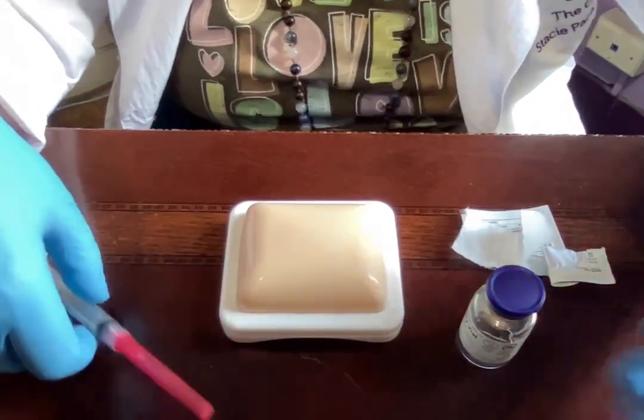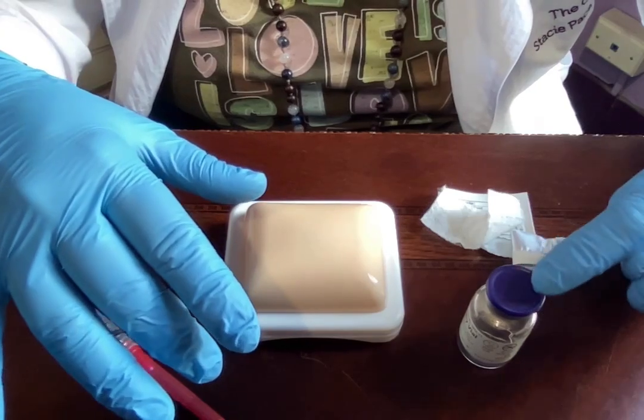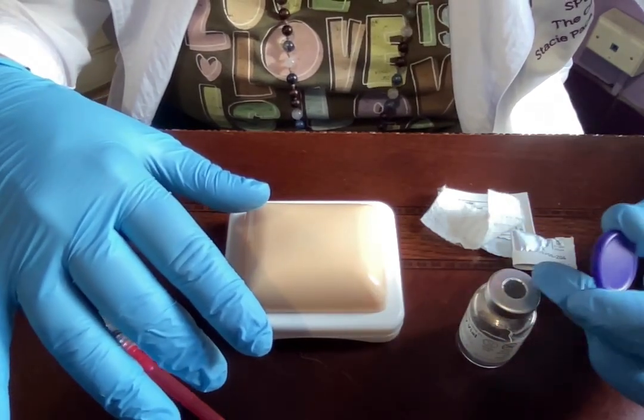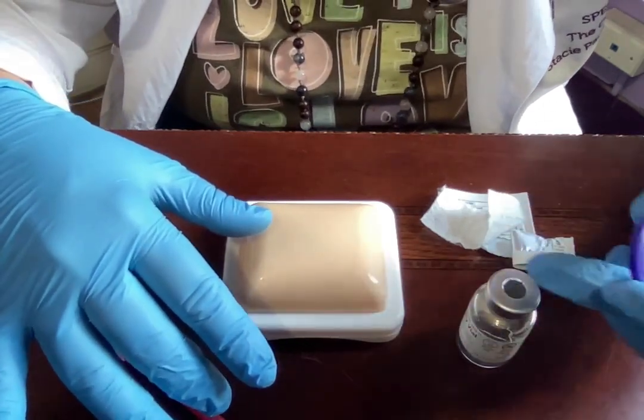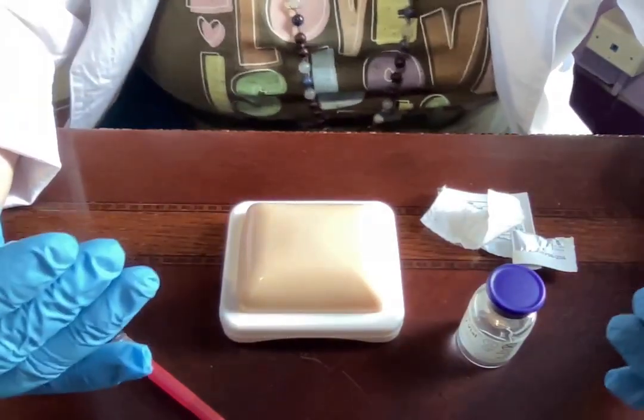Gather your supplies: your medication, your needle and syringe, your alcohol wipe, and yourself. The cap on the needle is considered sterile the first time you take it off, as long as nothing touches it. Every time after that you'll need to clean it off with alcohol.